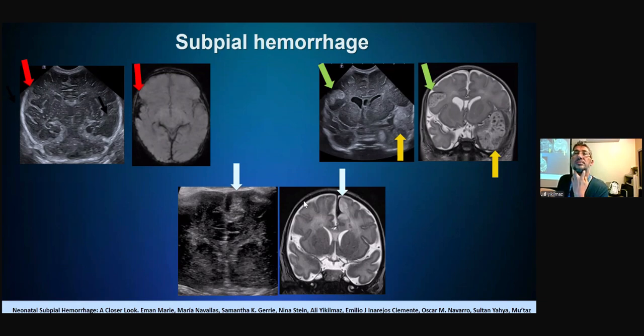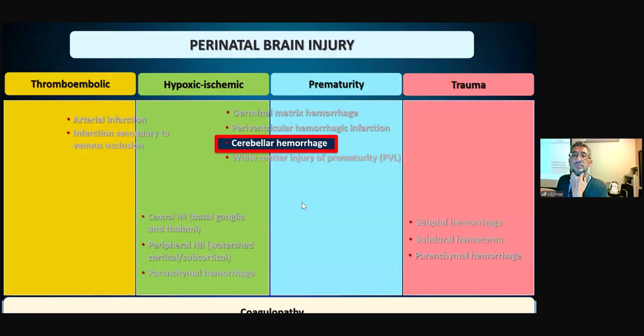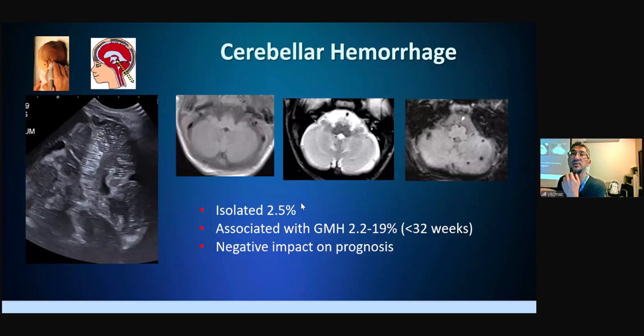For the cerebellar hemorrhage, are you also using the term germinal matrix hemorrhage? Yes, it's used, germinal matrix hemorrhage. Okay. But for the cerebellum, yes. Barkovich used it, so I use it.